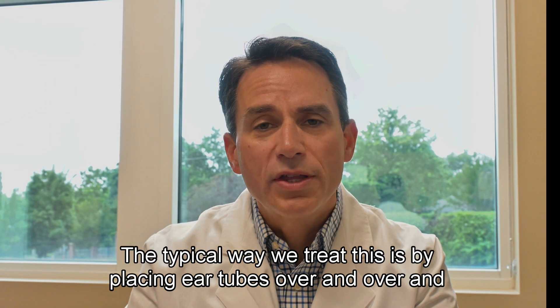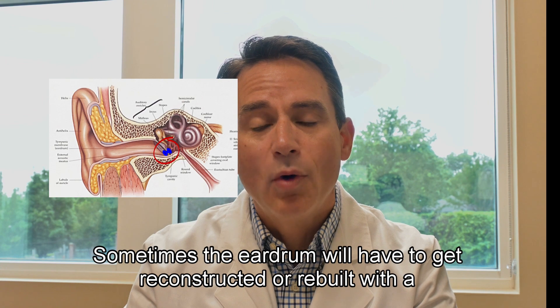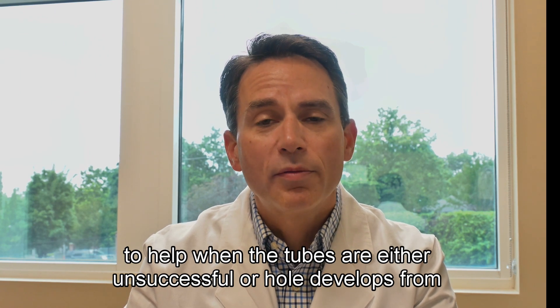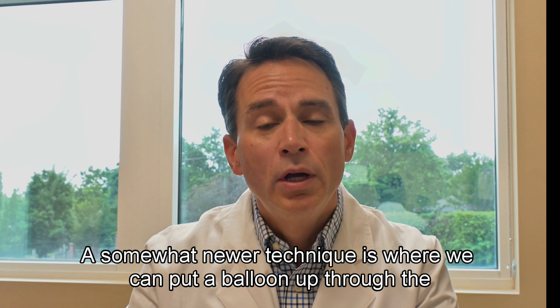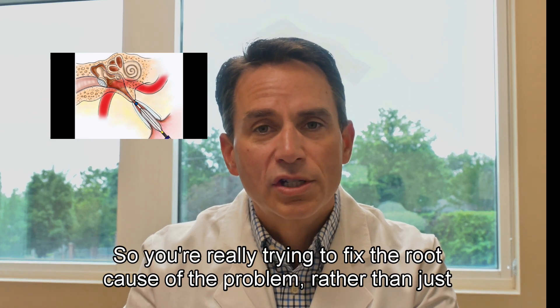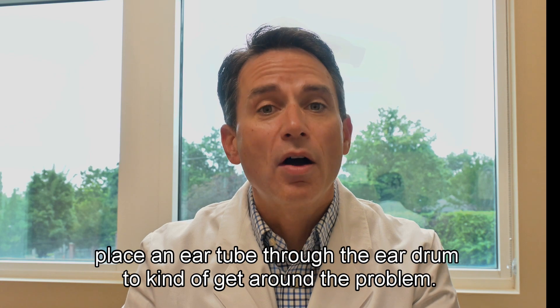The typical way we treat this is by placing ear tubes over and over again. Sometimes the eardrum will have to get reconstructed or rebuilt with a procedure called a tympanoplasty, to help when the tubes are either unsuccessful or a hole develops from recurrent tube placement. A somewhat newer technique is where we can put a balloon up through the eustachian tube and dilate it — really trying to fix the root cause of the problem rather than just placing an ear tube through the eardrum to get around the problem.